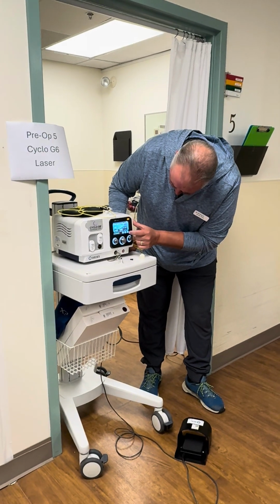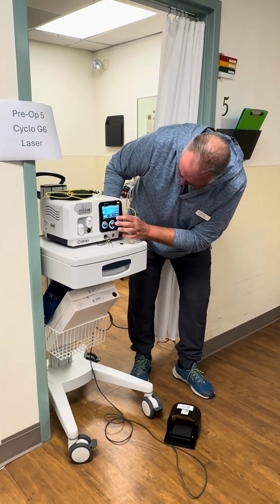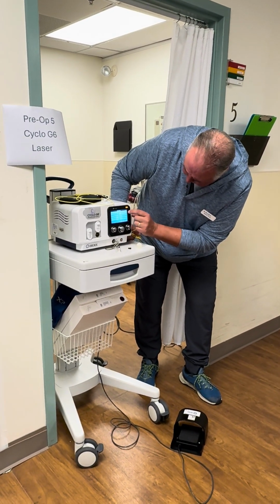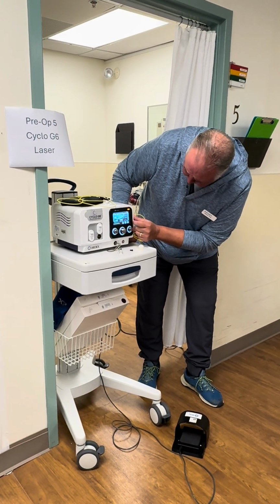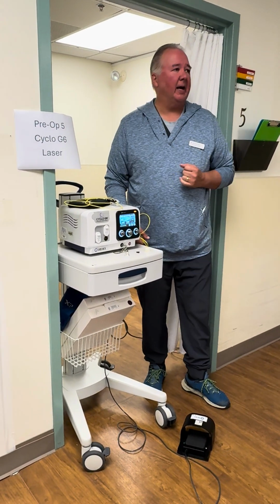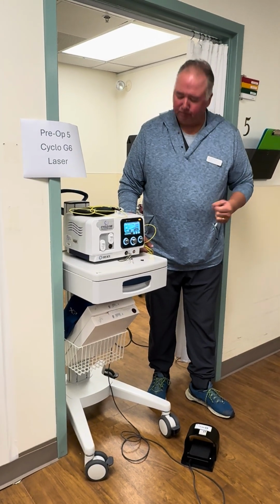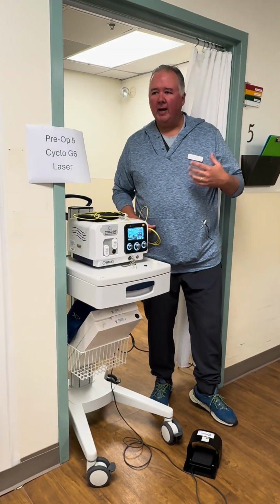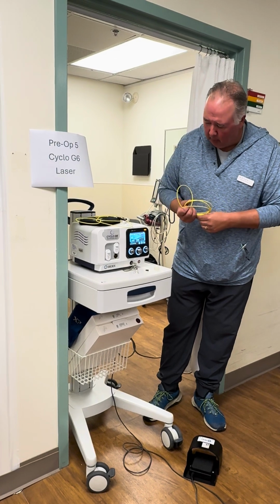Let's go back. Presets, so the light eyes, we'll view that one. So this one's 3.5 seconds, but it's a little bit more power at 1,500 milliwatts. So depending on where it's focusing the energy in the pigment of the eye, that's what the G probe is doing.